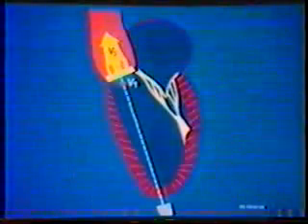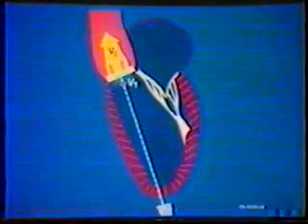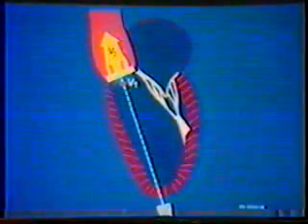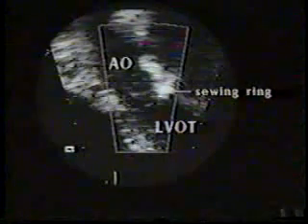After calculating the LVOT area, we need to obtain the time-velocity integral of flow through the outflow tract. For this, we use the apical long axis orientation and position the sample volume in the outflow tract just below the aortic prosthesis. The examiner must take care not to place the pulsed wave sample volume too close to the prosthetic aortic valve sewing ring.